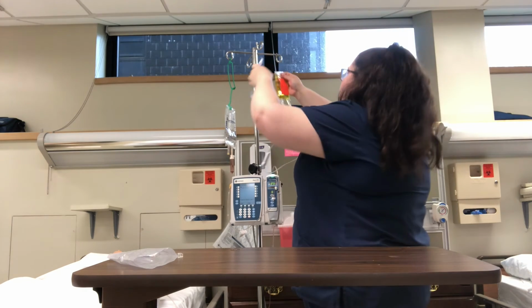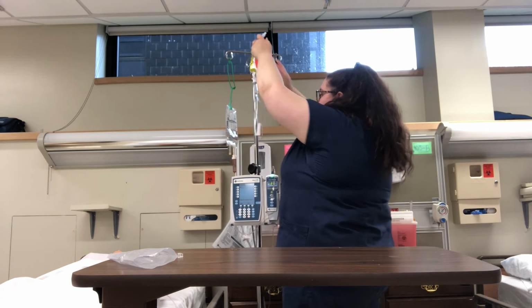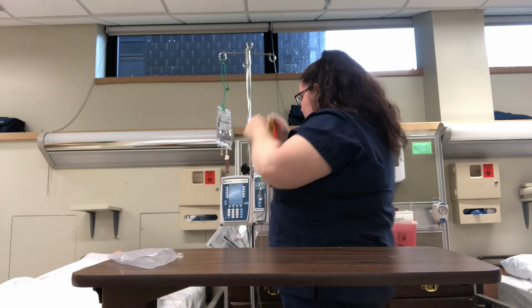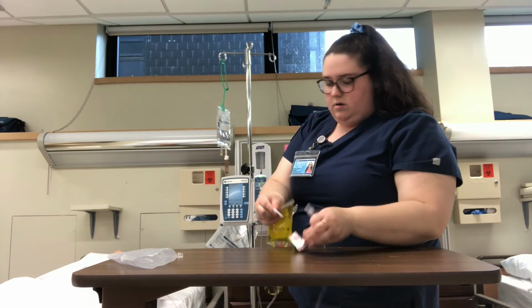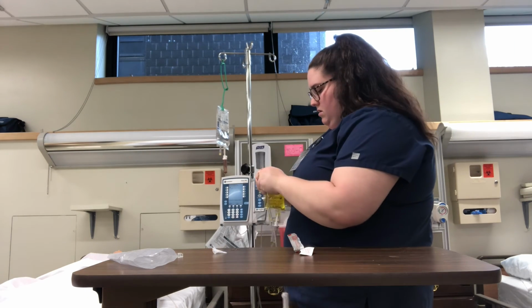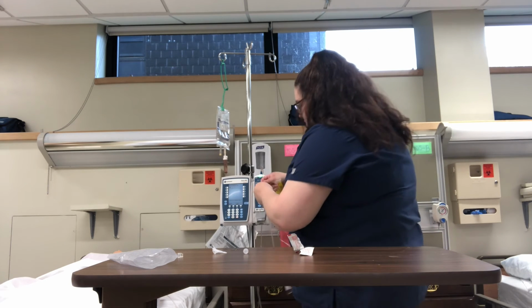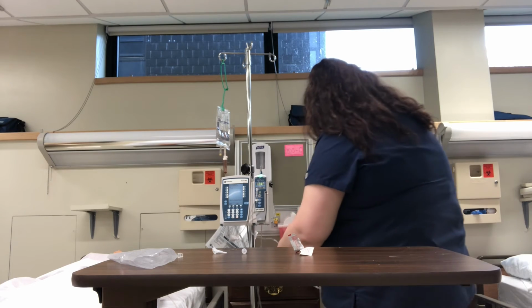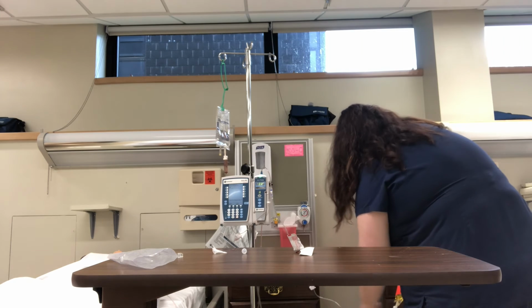I'm going to hang the secondary medication. Actually, before I hang it, I'm going to wipe off this. I'm going to open the clamp and back prime my piggyback.